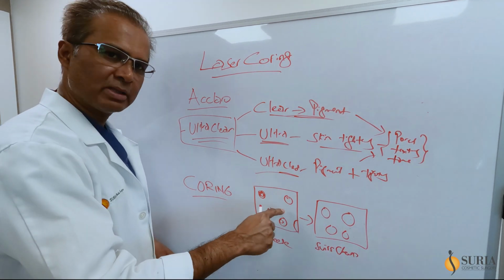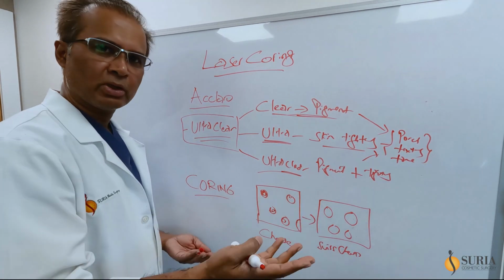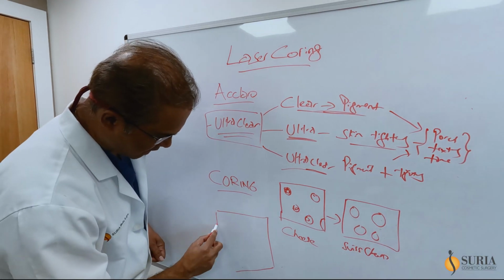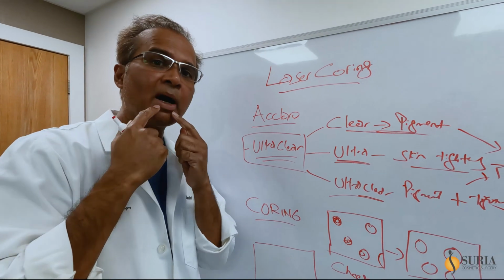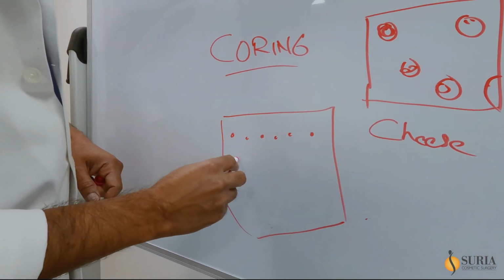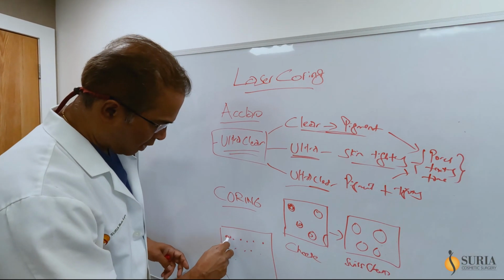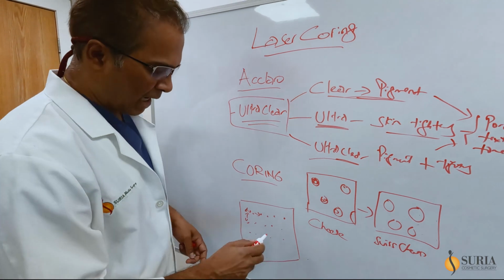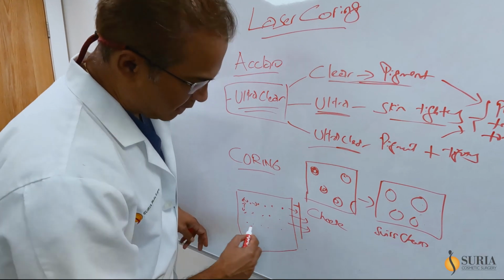Because if you have a broad, flat piece of cheese and you punch a bunch of holes in it, squeeze it together, the amount of cheese that you have left is less than the original because those little holes no longer have cheese. Similarly, when you do skin treatments, if you have a piece of skin, let's just say underneath the eyes, top lids, lower lids, corners of the eyes, around the mouth, maybe the jowl area, maybe the neck area, and you poke microscopic holes in a very regular, maybe irregular fashion to break it up at a certain density, which means how many you compact, how far apart you put it, how many dots you do, called the percentage or density, and how deep, if the skin is this thick, let's just say, how deep underneath do you poke the hole, is also something you can control.